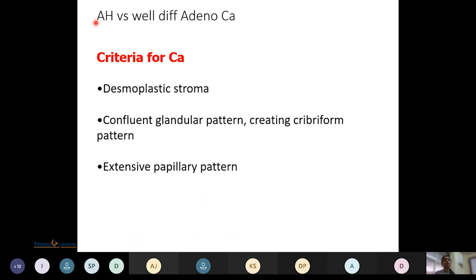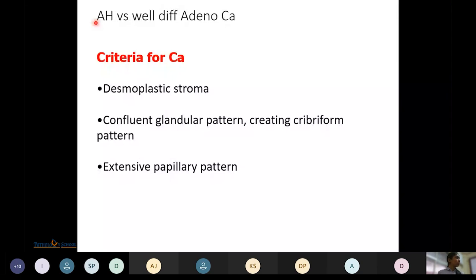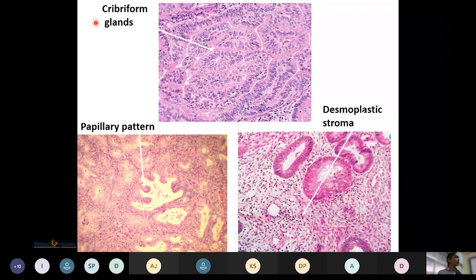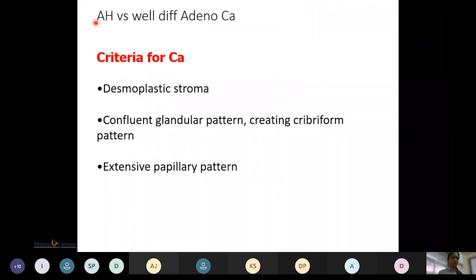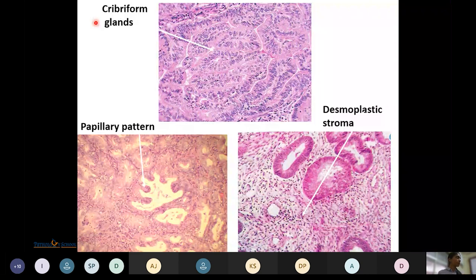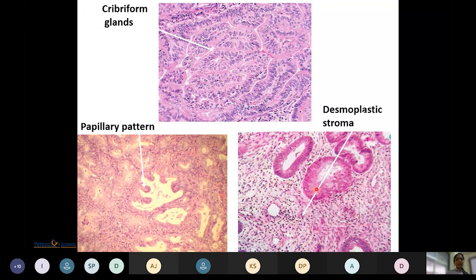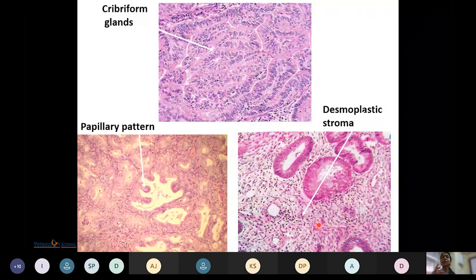Criteria distinguishing atypical hyperplasia from well-differentiated adenocarcinoma include desmoplastic stroma, confluent glandular pattern creating a cribriform pattern, and extensive papillary pattern. Desmoplastic stroma indicates malignancy; it shows low cellularity, is sclerotic and hyalinized, and blood vessel infiltration is disorganized. Foamy macrophages are also associated with desmoplastic stroma in endometrial adenocarcinoma.